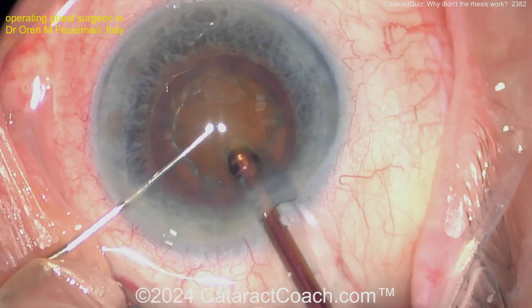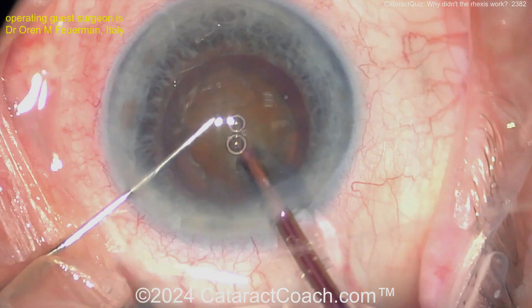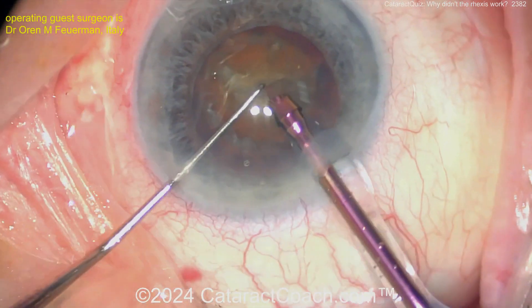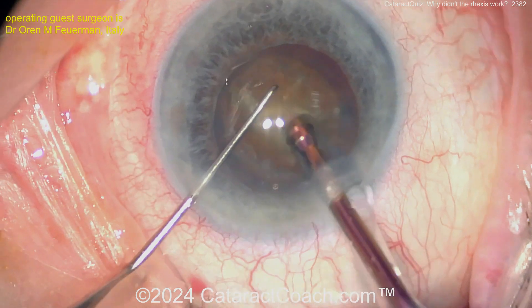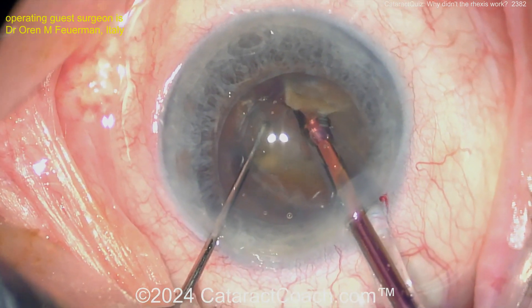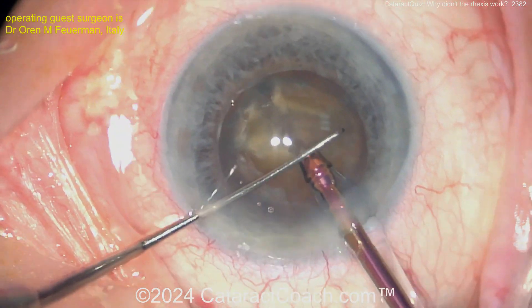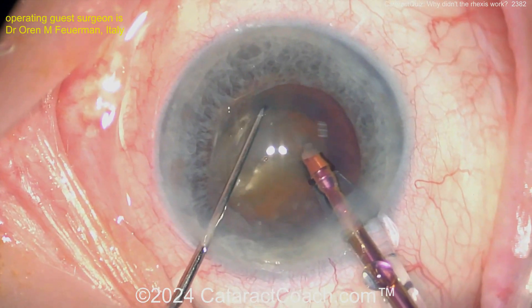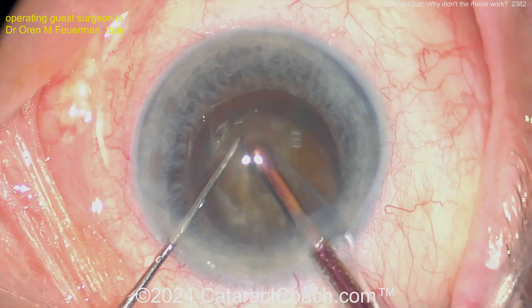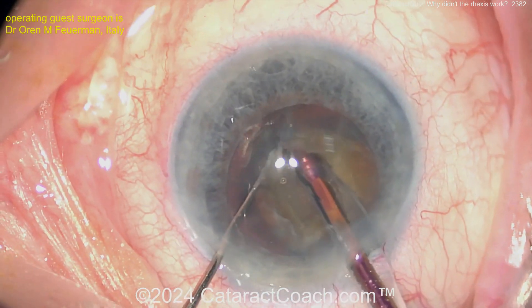Here's the technique — phaco. We've obviously sped the video up so it looks like buzzing with the phaco probe, and perhaps a vertical chop. Beautiful — get that propagated, buzz it on the probe again. There's the chopper, nicely done — propagate that chop all the way through and rotate.